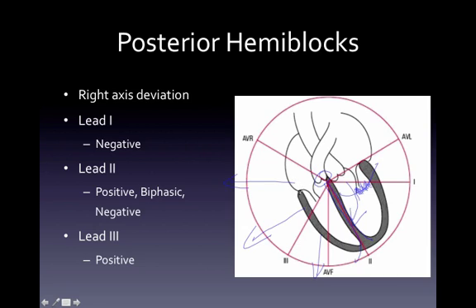Whether it's almost at 179 degrees, it's at about 120 degrees, or it's at like 91 degrees. Now, to everybody's perspective, lead 1, remember this is a positive electrode, so if we're at 91 degrees, this is going to be below the isoelectric line.